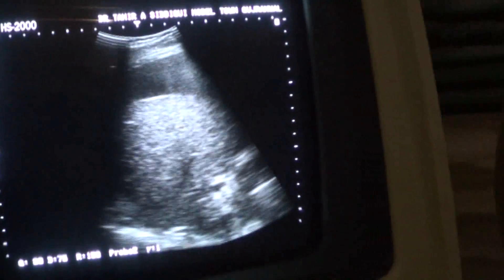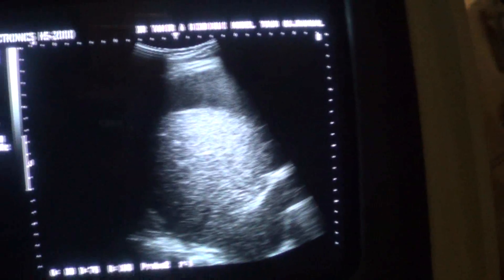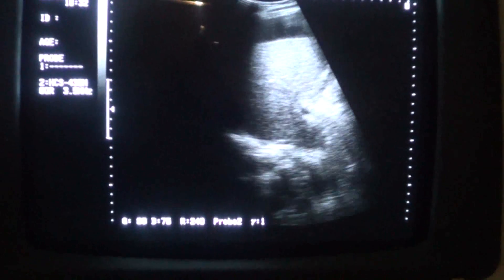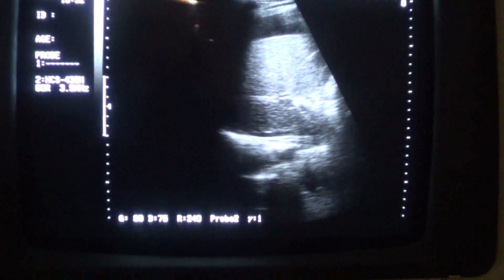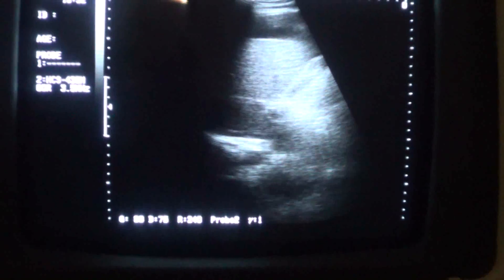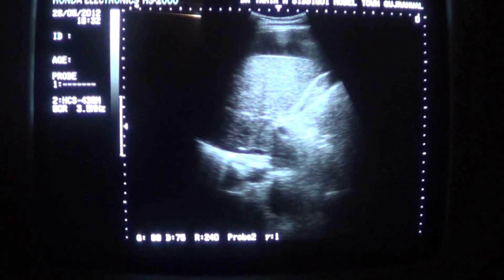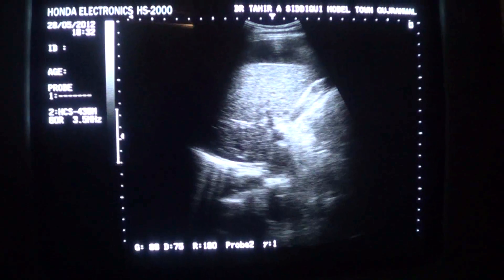This is the gallbladder. It is also normal.